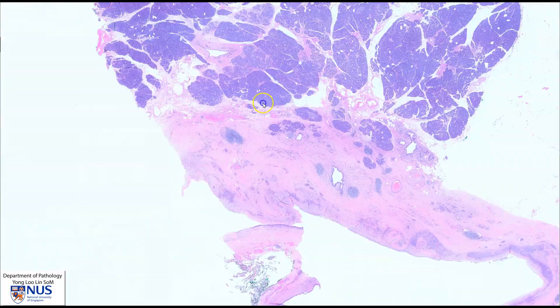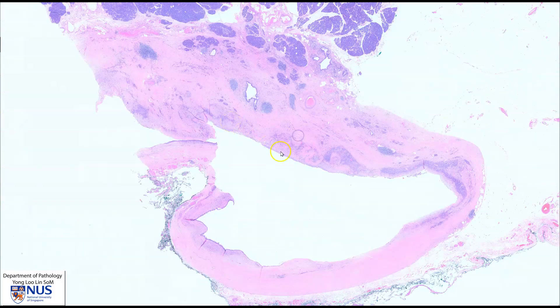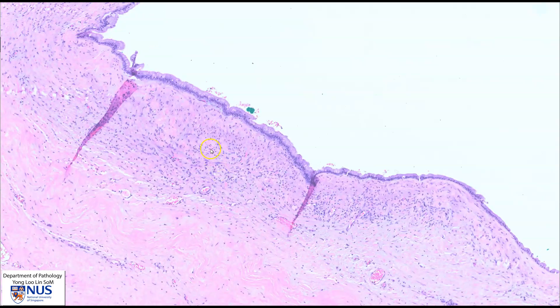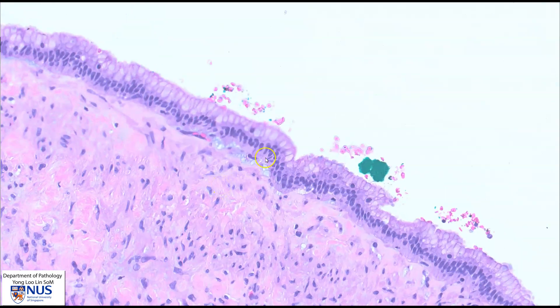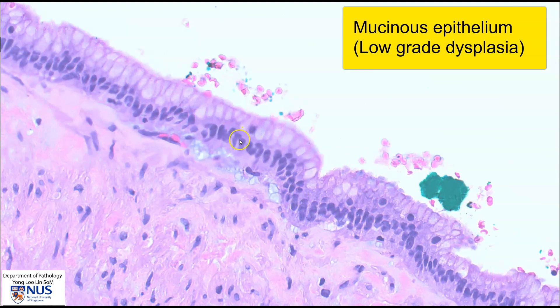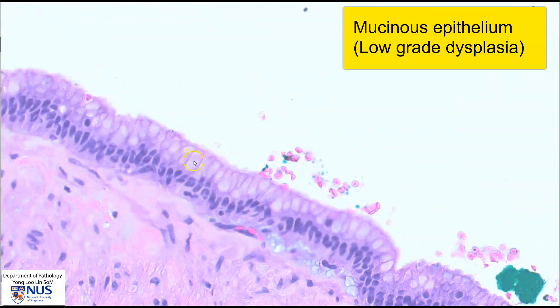Now let's move to the area of pathology. Here we can see one of the locules of this cystic neoplasm, and the epithelium lining the cyst locule is columnar. The nuclei are very basal and polarized, and in this area they are extremely uniform.